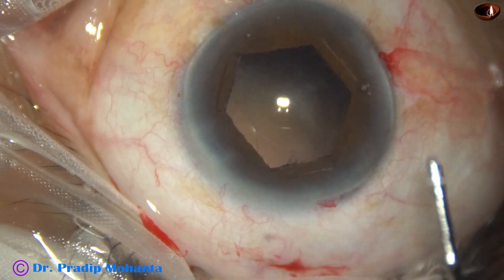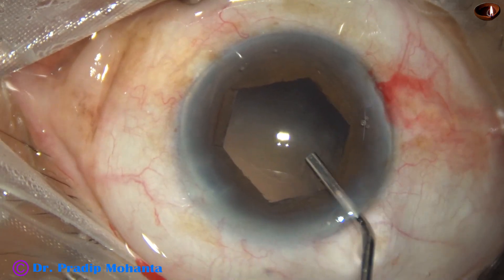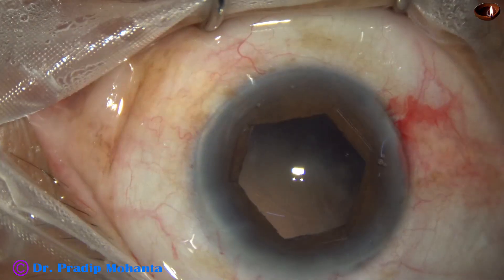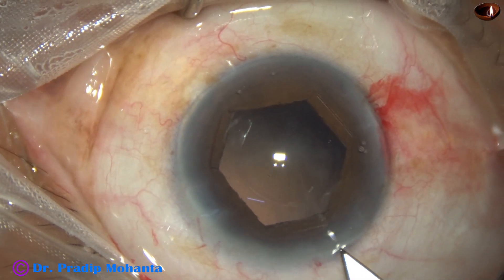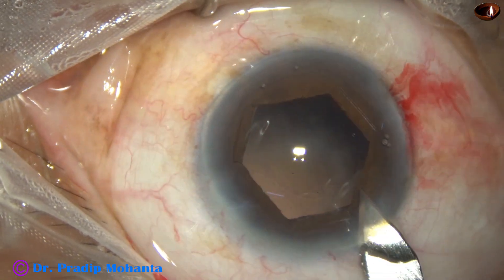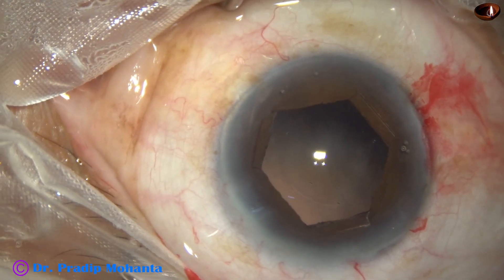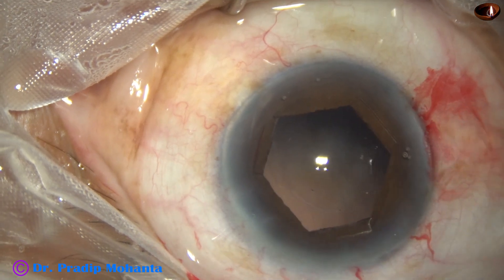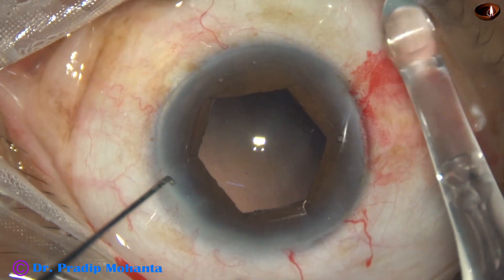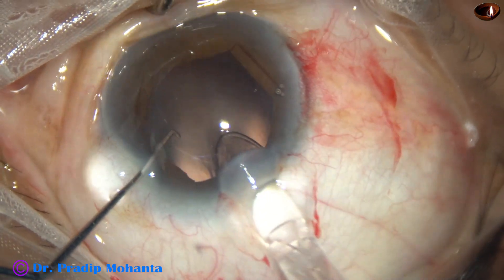Cortical cleanup has been done. I now inject viscoelastic to fill the anterior chamber and fill out the capsular bag. I enlarge the main wound a little more because of the B-Hex — whenever B-Hex is in place, I enlarge the main wound to about 3 millimeters so that the tip of the cartridge goes beyond the flange which is over the iris.